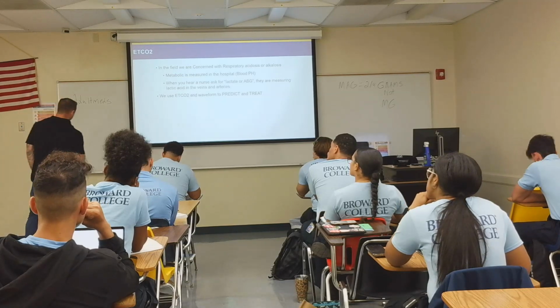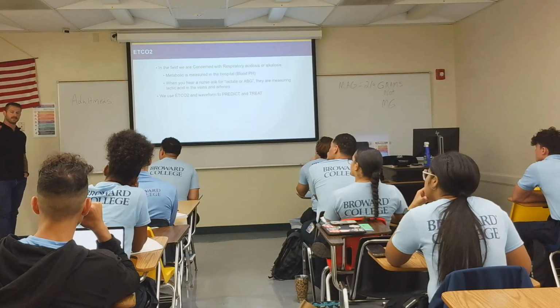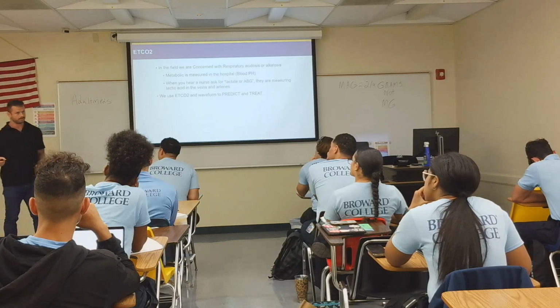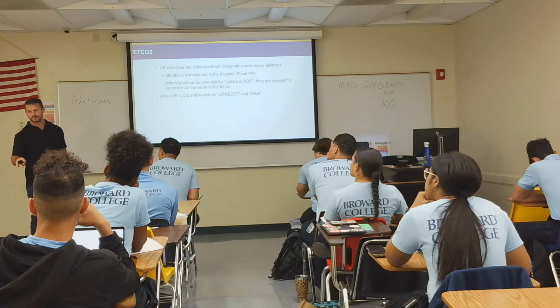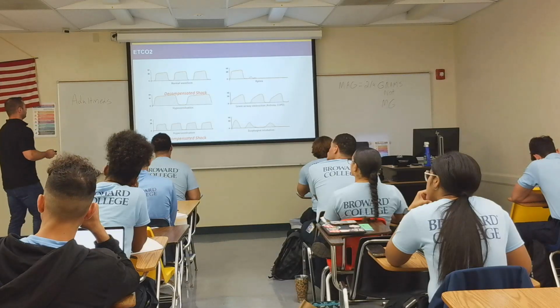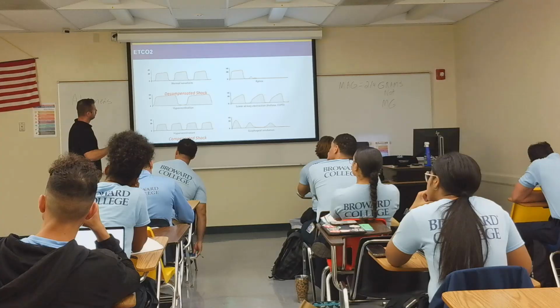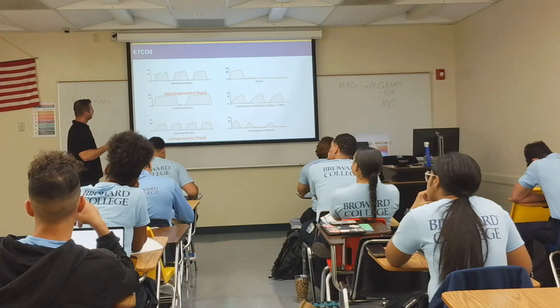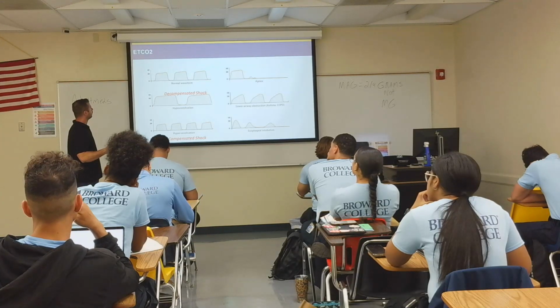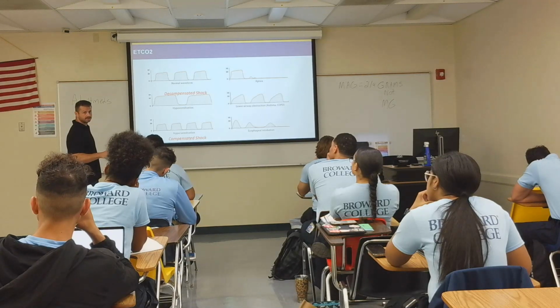So first things first, let's talk about hooking up our CO2, right? When you're in the field, and someone hands you an end tidal, how do I hook that up? Do I put it on the patient first or the monitor? Monitor, right? So I screw that orange thing into the life pack, right? It's gonna start making a line, go all the way across. Once that line's connected, that means I can connect it to the patient.